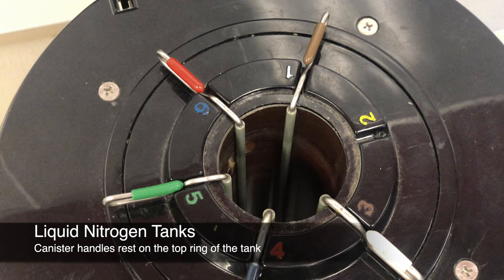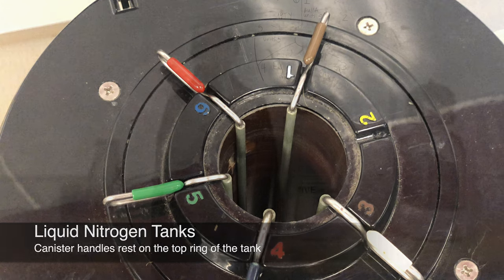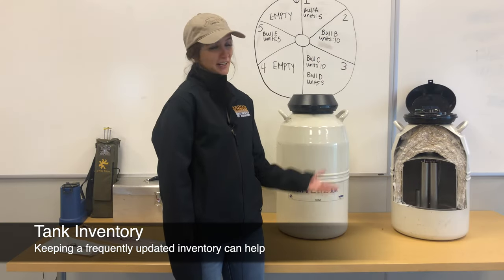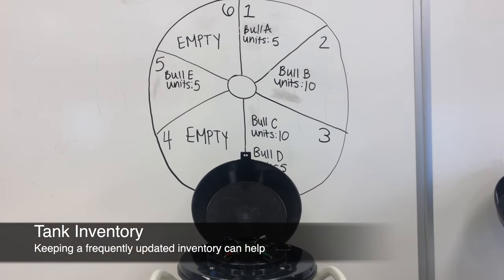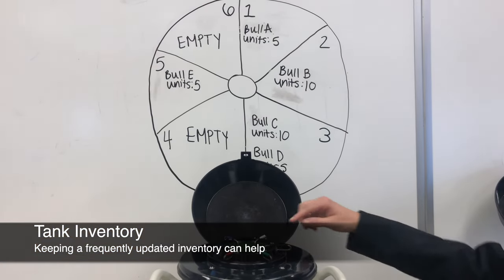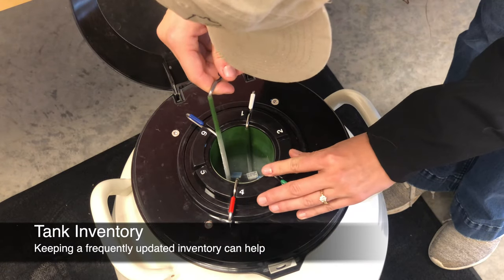The canisters have handles that rest on the outside of the tank, and most tanks will have a numbered ring where the handles rest. Keeping a frequently updated inventory can help you find the straws you want to retrieve in a timely manner. Having a detailed map or labels indicating where each individual bull's semen is located can help you quickly identify which canister the desired straws are in.